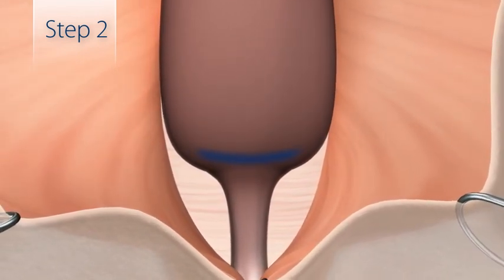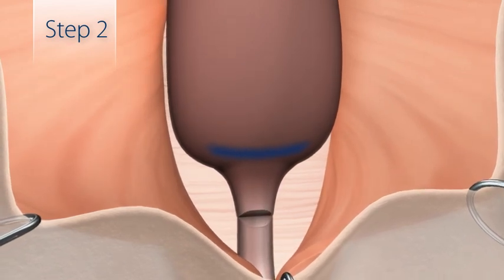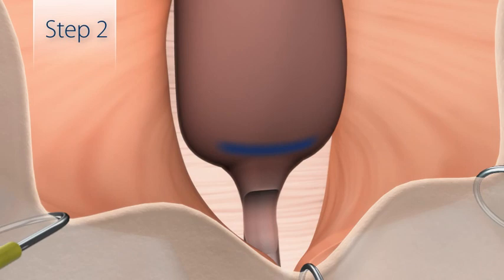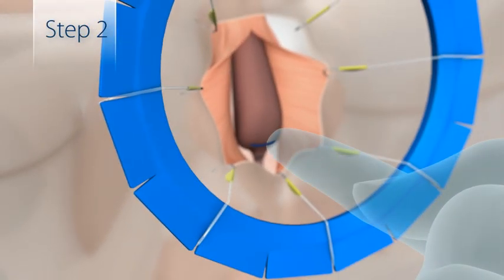Gradually incise the fibrous portion of the central tendon, pausing frequently to check for bulb mobility until a 2 to 4 centimeter proximal displacement can be achieved.